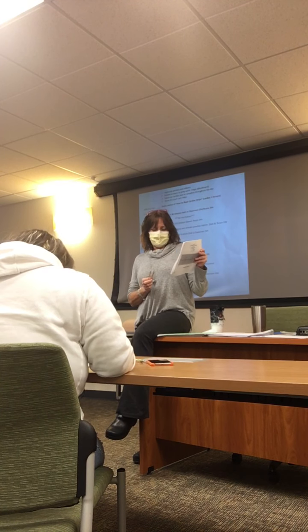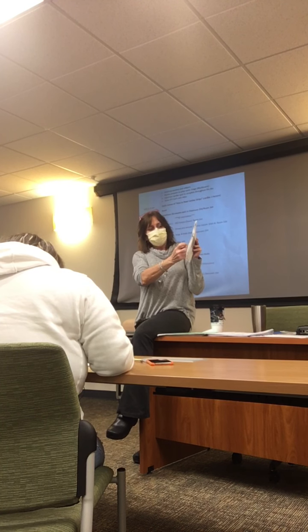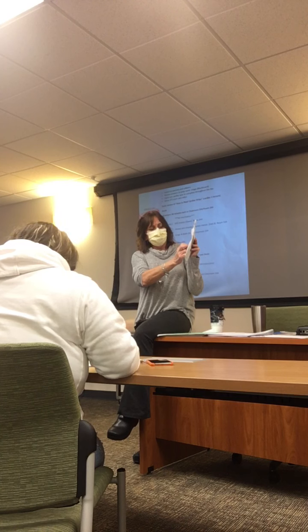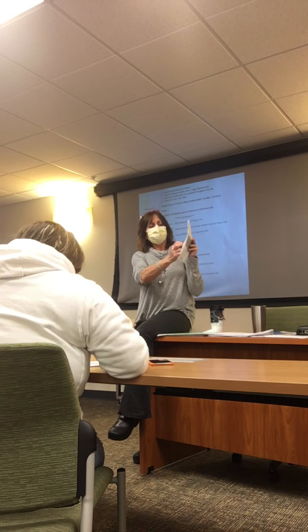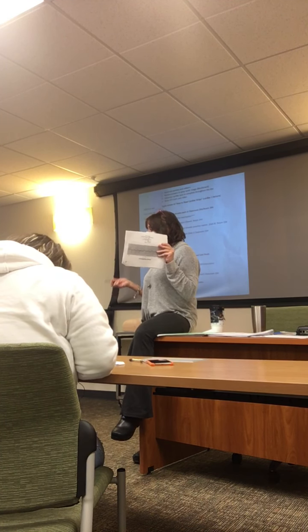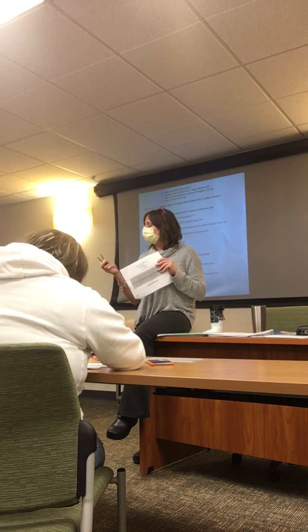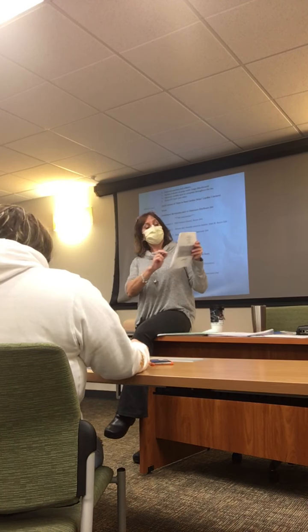Yes. So the rhythm, regularity. So I'm going to take my calipers, or my paper if I don't have calipers, and measure from R to R and kind of plot it out, walk it out. Does that look regular to you? Is it equal? Yeah. So my ventricular rate is equal, so I'm going to say my pulse is regular. And you guys know when you're putting in vital signs, that's one of the things it will ask, is it regular or irregular a lot of times.